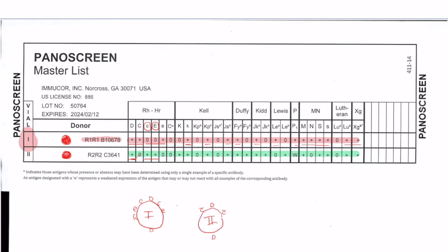So we'll draw that membrane again and we'll put a big E on there. Okay. Screening cell 1 had little e. This one has big E. And so as we go across here, we can see what it's positive for. Okay, so this is important to understand. And because those are positive on there, if the patient has an antibody, let's draw an antibody here. Remember how we designate them. And these are specifically, we're looking for IgG ones at the moment in this testing.